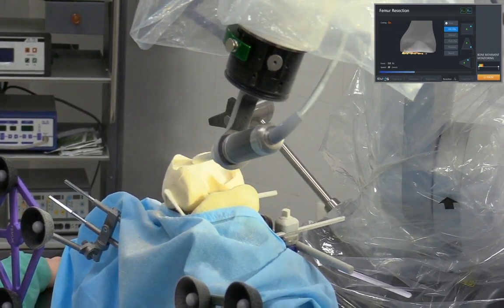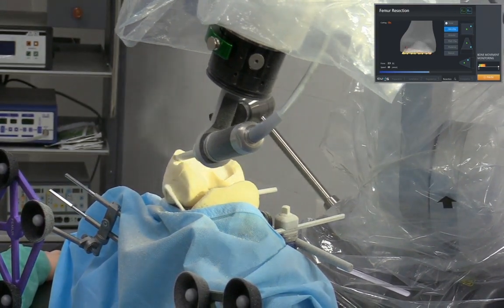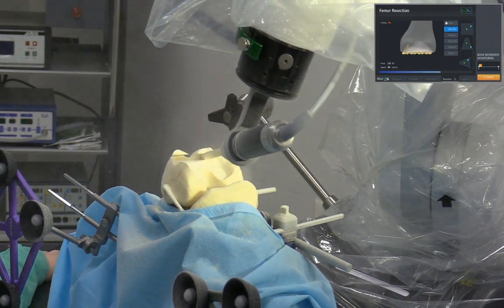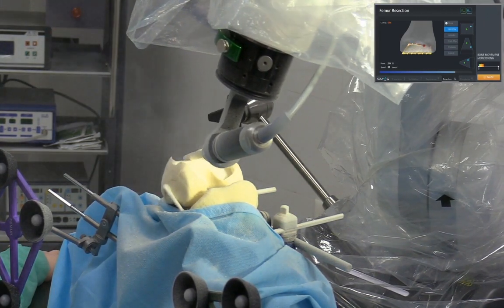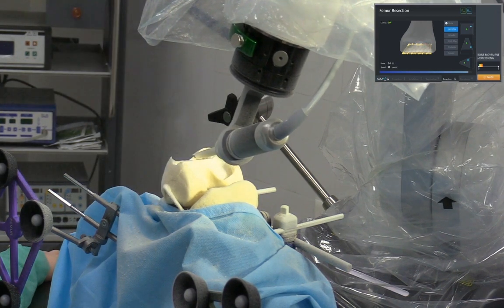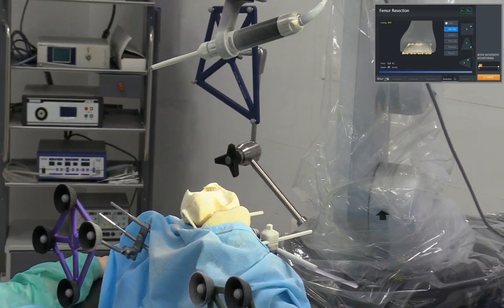On the left bottom of the screen you can see the speed right now is 35, 40, 45, and when you want to reduce it, you can reduce it. The maximum is 50. You cannot go beyond that. The cutting tool, you can see, is cutting really fast, and then you just have to go slow. So this is also a safety feature wherein you as a surgeon have a way to control the speed, increase or decrease the speed.